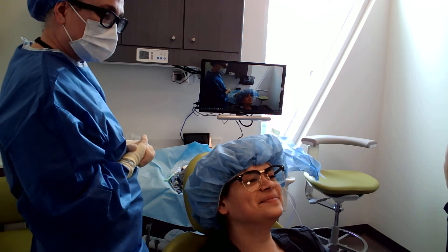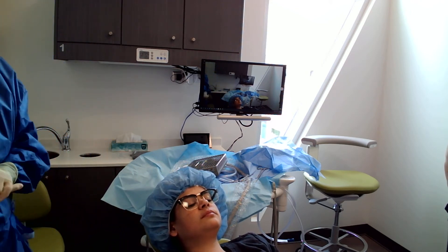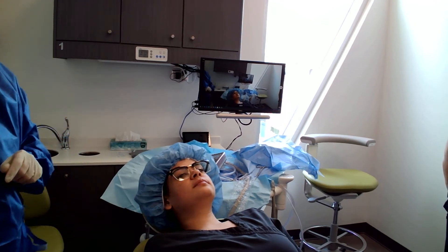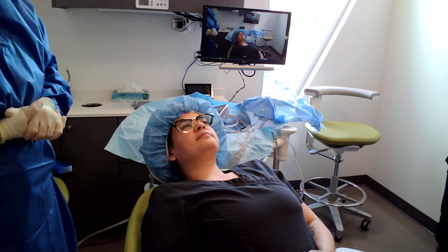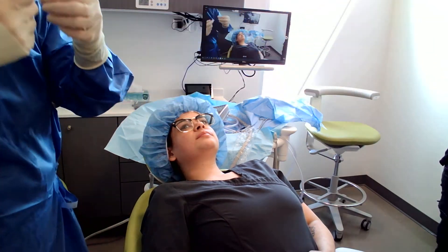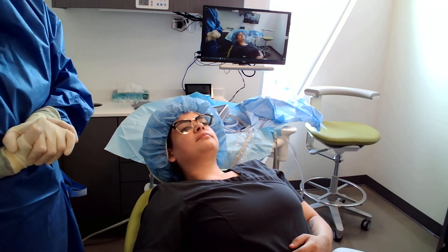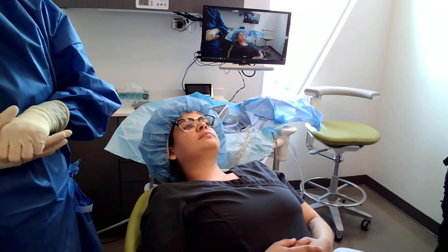If Courtney was having sedation, at this point Nina would be putting vital sign monitors on that we leave on during the entire appointment. She'd be opening up a little nasal cannula and putting the breathing apparatus into her nostrils. Patients really like that — it's almost like a spa. They're getting oxygen and an IV, which I always tell them to hydrate before. That cannula would stay on through the whole procedure, and this would be about the point that we'd put it on.